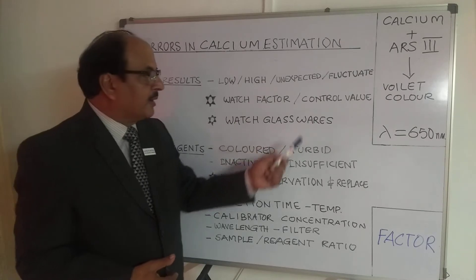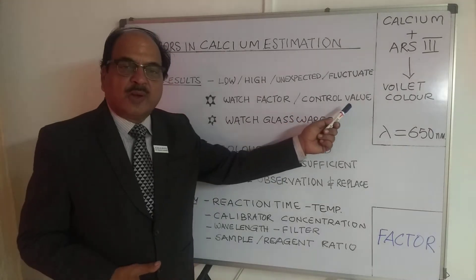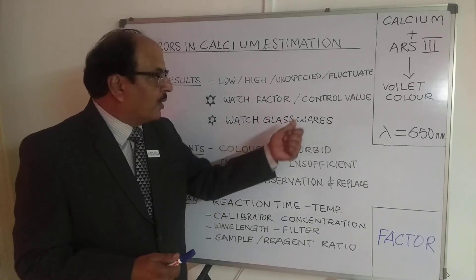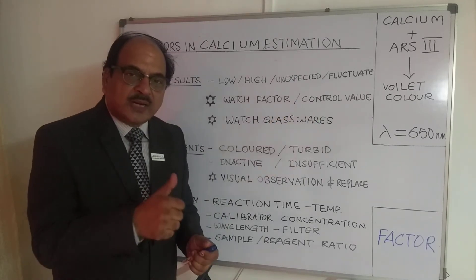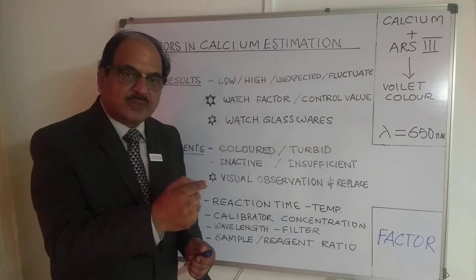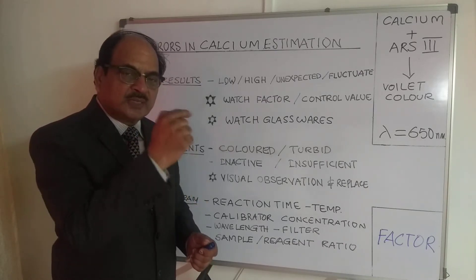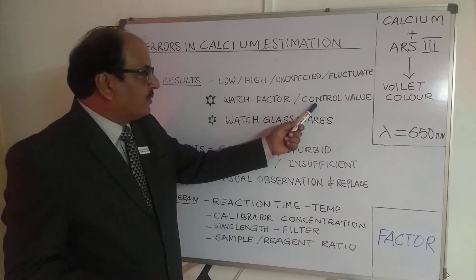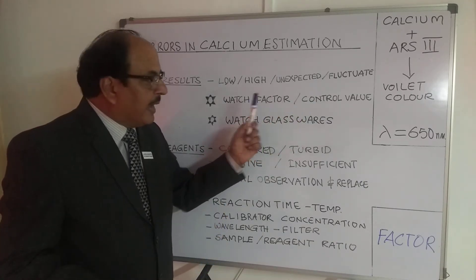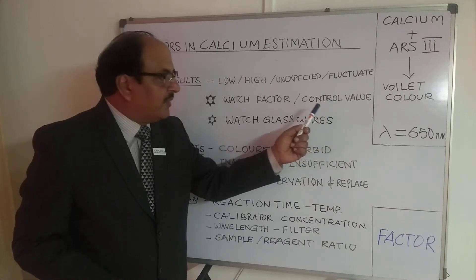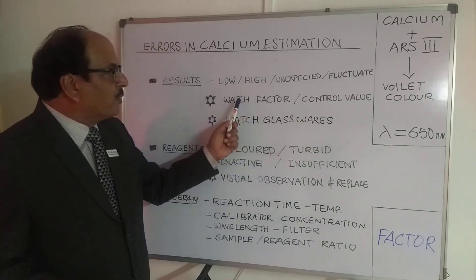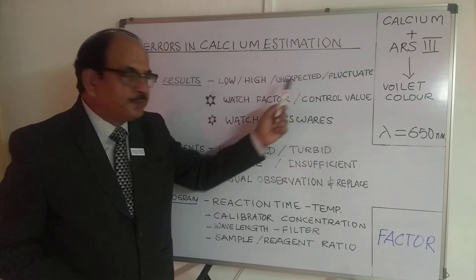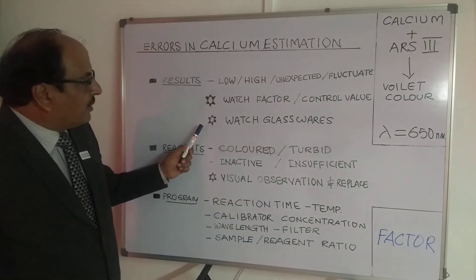You need to see that the factor remains constant throughout your assay. If there is any deviation, you need to recalibrate. Additionally, run a control serum whose value is known to you, and ensure that the calibrator or control values are lot-specific — referred to by the lot number. If both the factor and the control serum are taken care of, most high or low result errors can be eliminated.